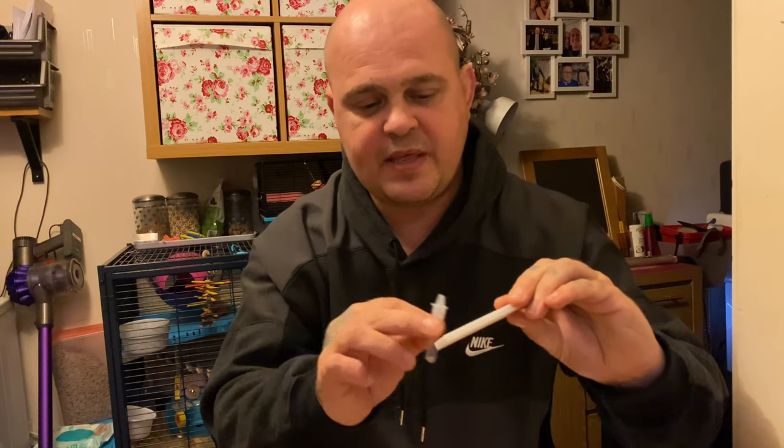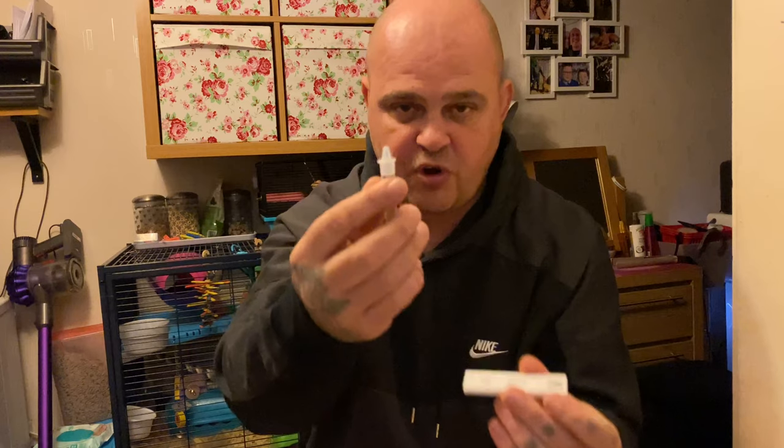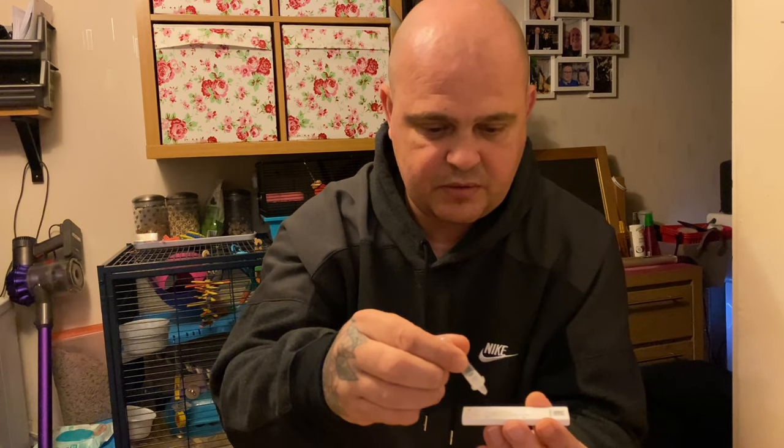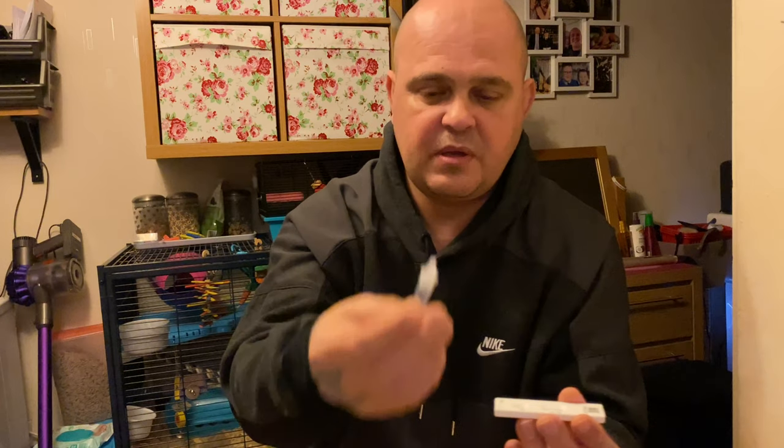Then get your test cartridge and where the 'S' is, put two drops of the fluid in — one, two. That's it. You can then discard the swab and the tube, just throw them in the bin.